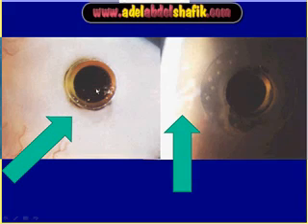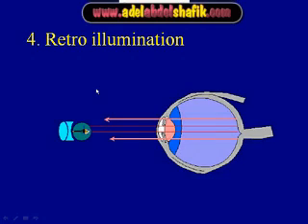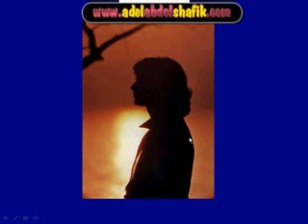Retro illumination means that you are going to illuminate something behind and then examine something anterior. Here you can see this young lady as a silhouette against the illuminated background. This is the case of a keratoplasty.